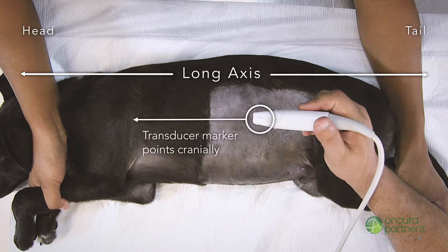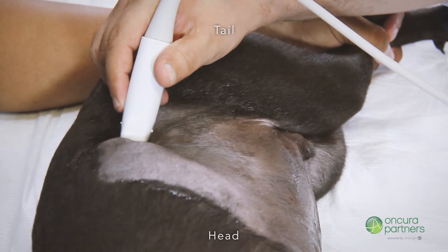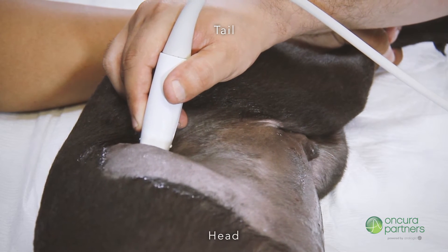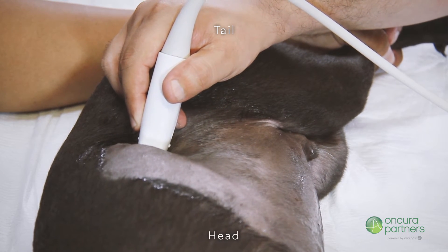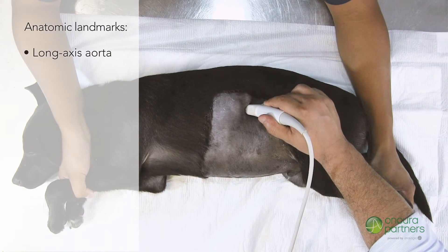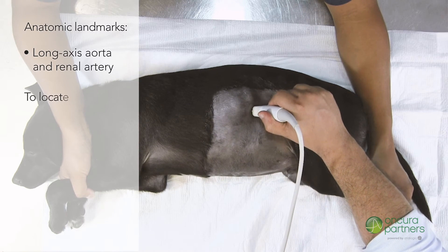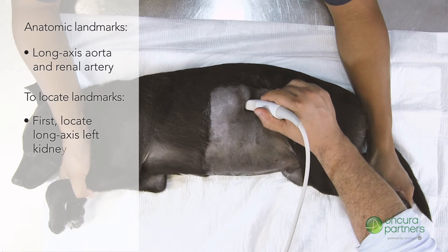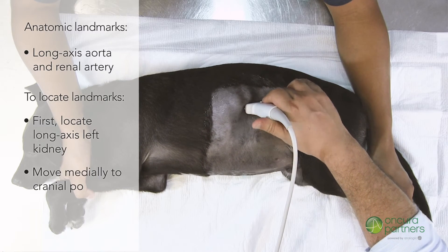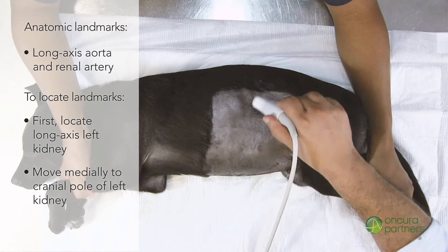To begin in the long axis, point the transducer marker towards the patient's head. Place the transducer in the long axis caudal to the last rib dorsally and begin searching for anatomical landmarks. The first anatomical landmarks are the long axis views of the aorta and renal artery. To locate these, first find the long axis view of the left kidney, then move medially to the cranial pole of the left kidney until the landmarks are visualized.